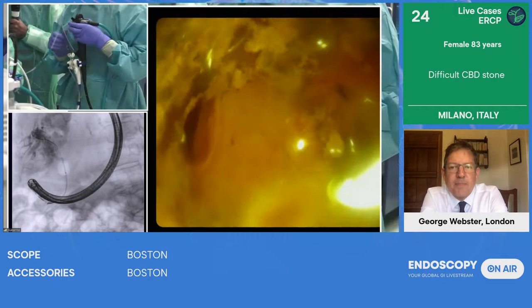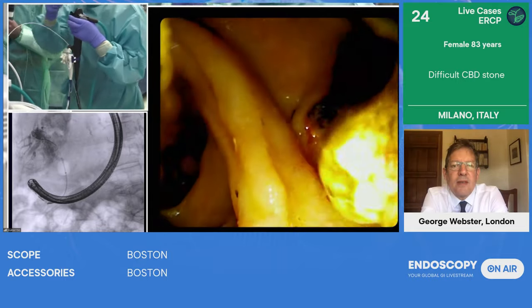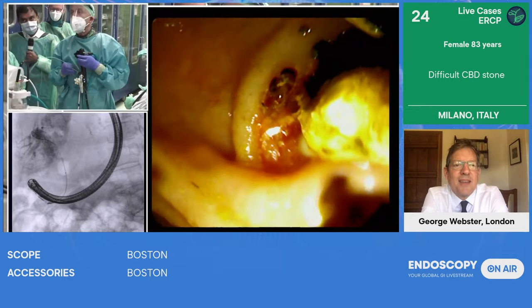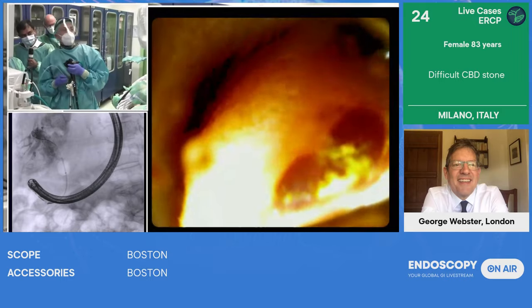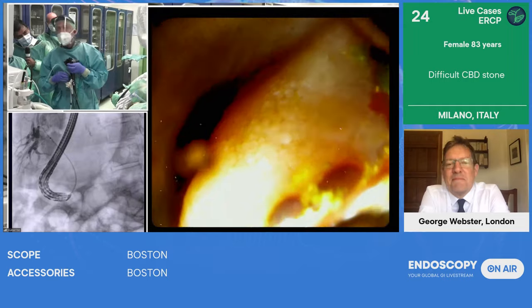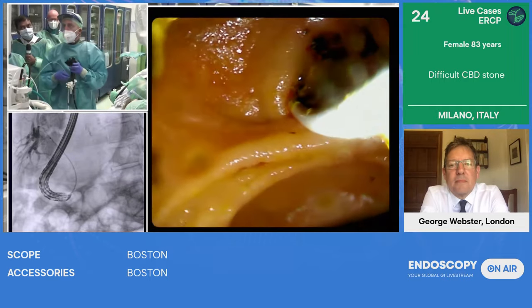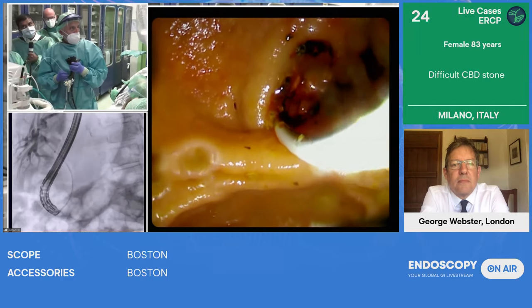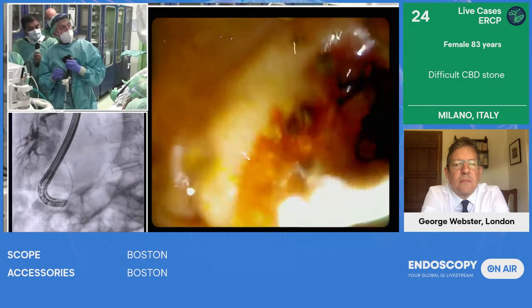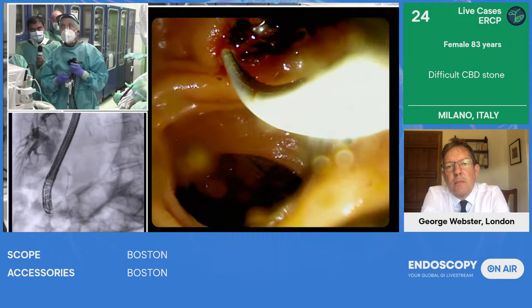Like when you are fishing with a tuna fish, deflate, you need to leave a little break in order to give the last movement. So I think right now we can go in again, inflate again, contrast. A lot of fragments came down. I think an important teaching point is not to pull the balloon, but just to drag it in the axis of the scope, and then that lets the stones come out. Okay. Actually, this is very important.